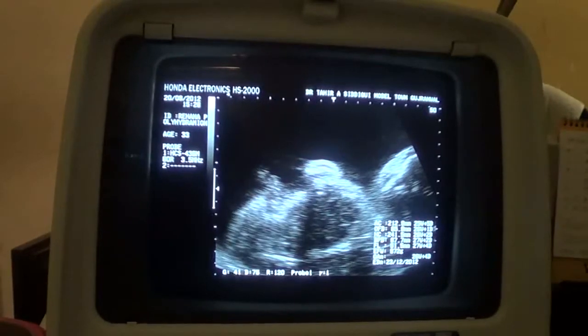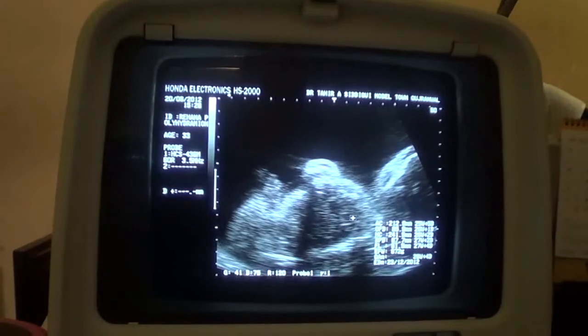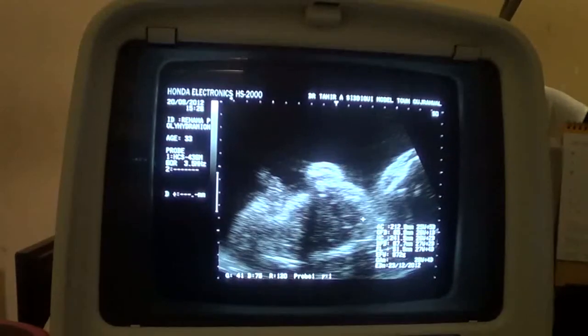Now this is the heart. This is the heart.